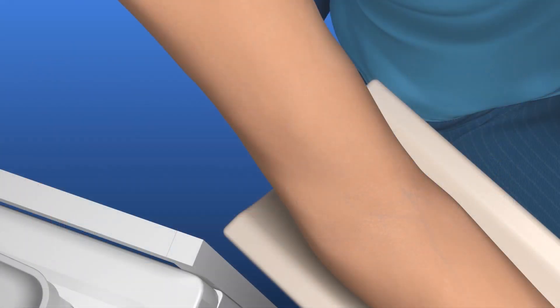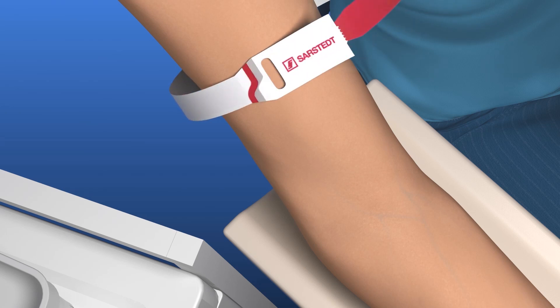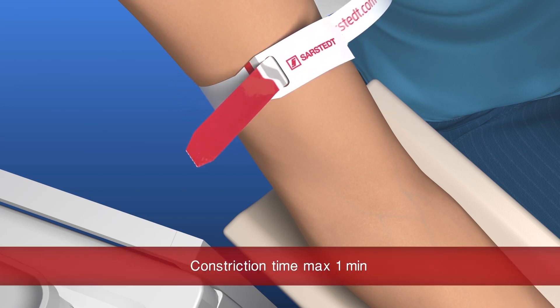Apply the tourniquet. For optimum sample quality, the tourniquet should be left on for a maximum of one minute.